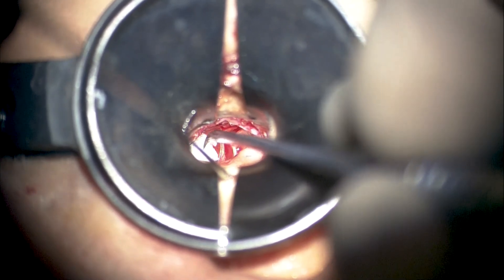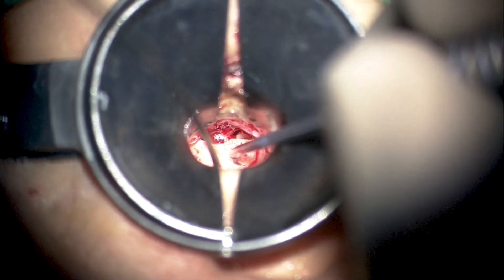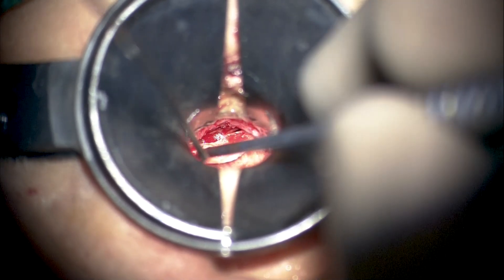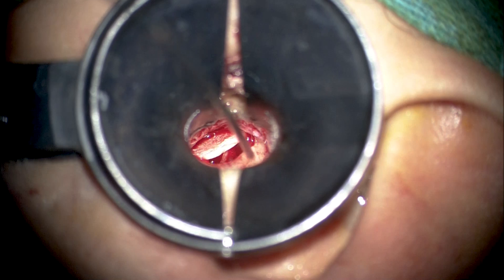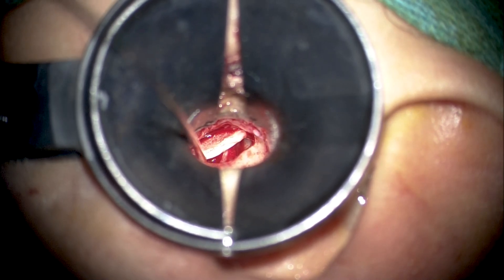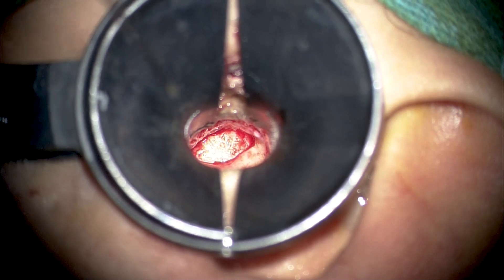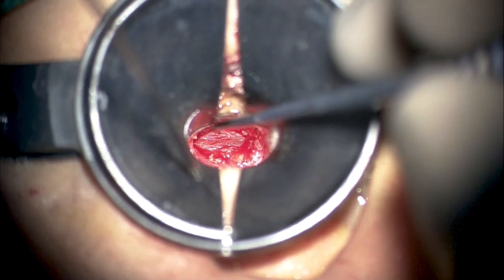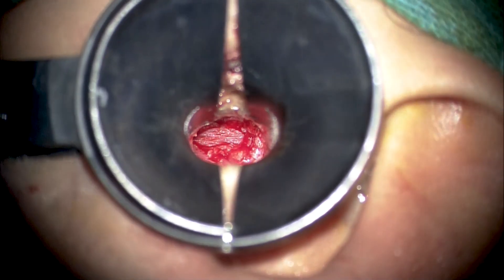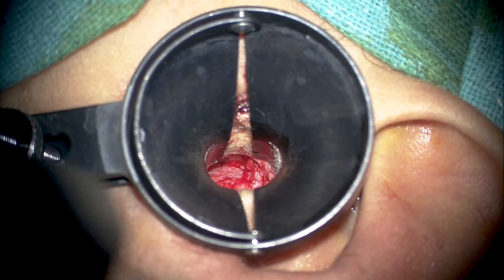We can now use a small amount of gel foam to be placed in the middle ear as support. We need to keep it only in the inferior portion of the middle ear, because superiorly the chorda tympani and the long process of the incus act as vital supports to our cartilage. We take the semi-lunar shaped piece of cartilage and place it with the perichondrium side facing laterally towards the skin, and the bare side facing towards the middle ear ossicles and the medial wall of the mesotympanum. Once the cartilage is securely placed with the gel foam support, the tympanomeatal flap is put back with no tear, sitting nicely onto the augmented cartilage.